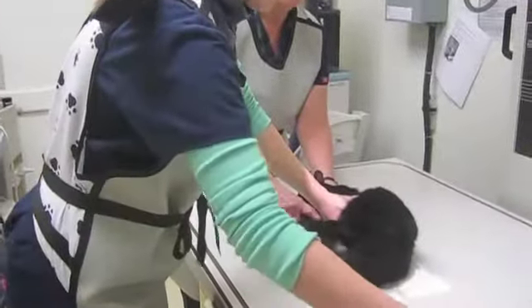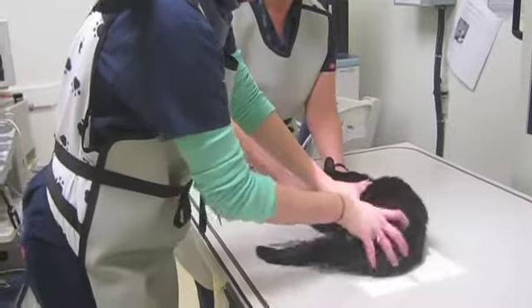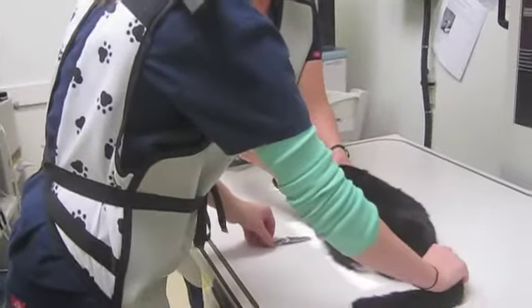After each x-ray, you want to be sure to label each x-ray with the appropriate time and date to ensure they do not get mixed up.